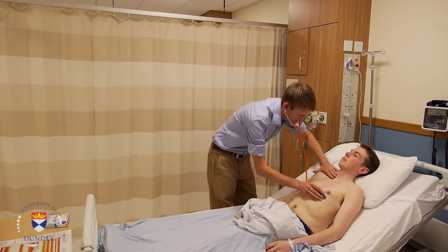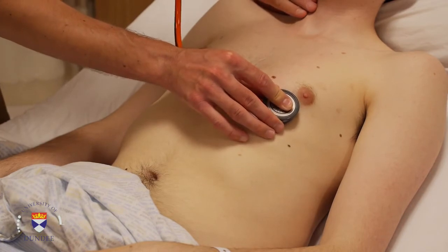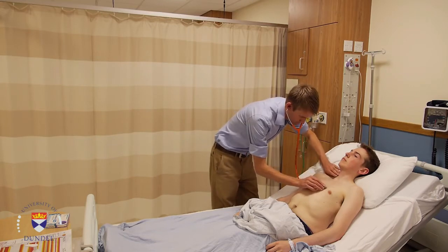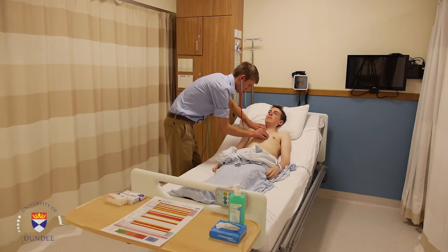You should listen with both the diaphragm and the bell at each location, noting the presence of normal heart sounds 1 and 2, as well as any splitting, added sounds or murmurs. Feeling the carotid pulse at the same time will help to identify the timing of any added sounds. Proceed to listen to each of the other 3 valves.